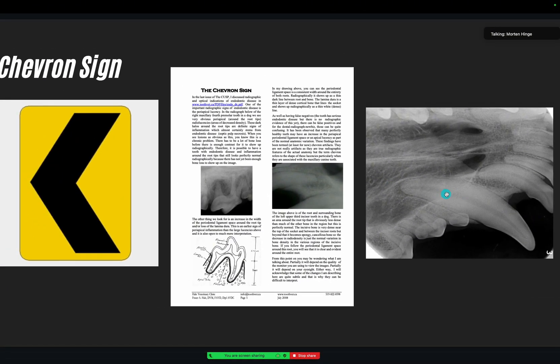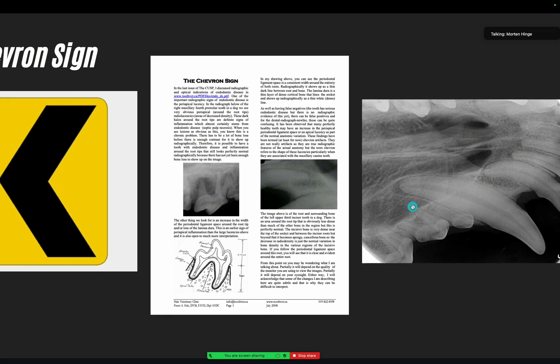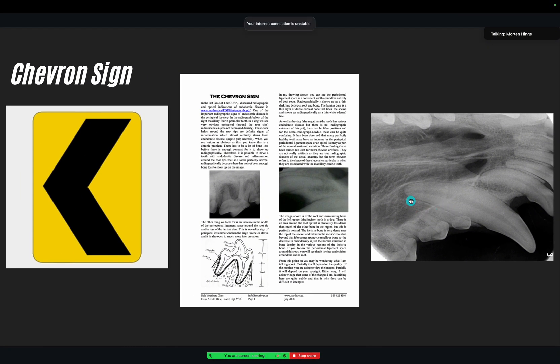Then you look at the tooth and you check the pulp canal size and you compare it with the other tooth and you see it's the same, and there are no signs of trauma, nothing going on, the tooth is not discolored — so it's probably not an abscess.